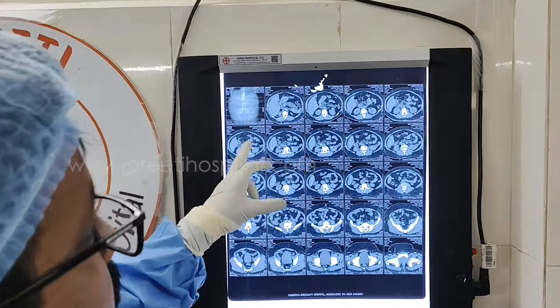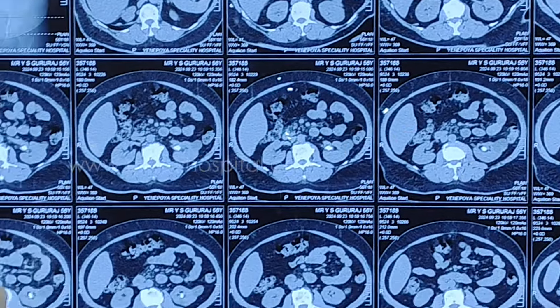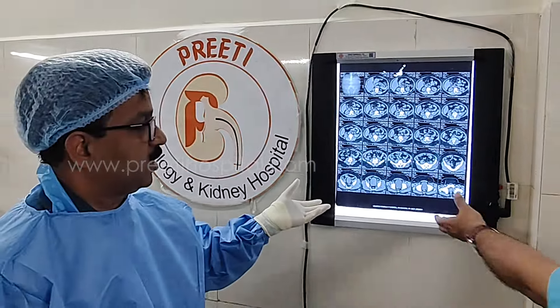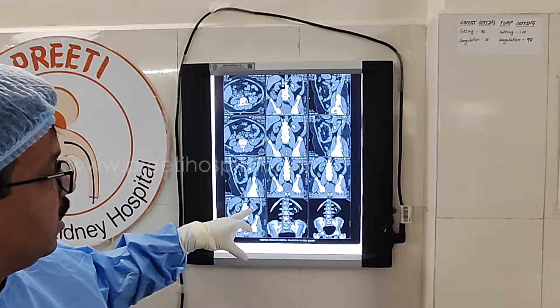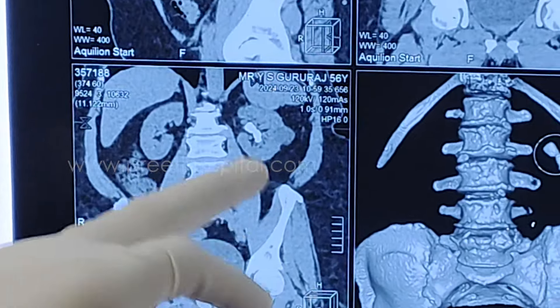But because of the fan suction sheath, surgery can be done faster. If you see the CT here, there is one stone in the pelvis, then slowly the stones are coming to the inferior calyx, there is one cyst here. Overall, this is a large volume stone. Ramakrishna, keep the reconstruction so we can understand how large it is. It appears to be 2-3 stones — it will be around 2000 cubic mm large volume.